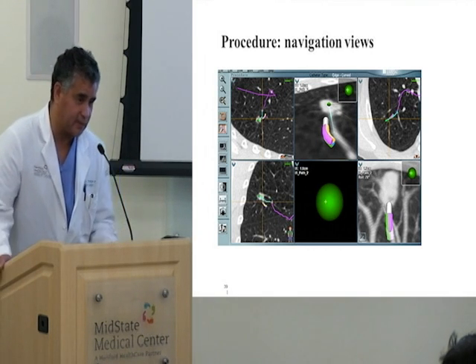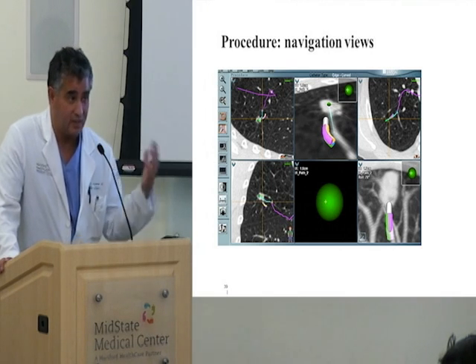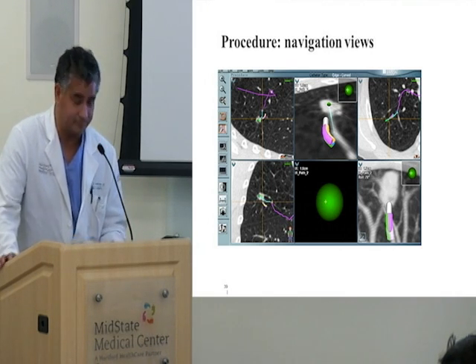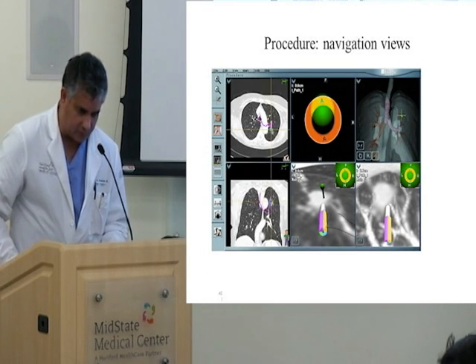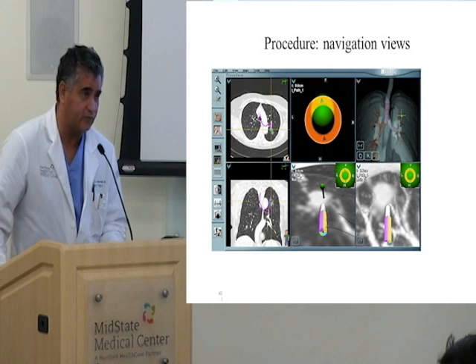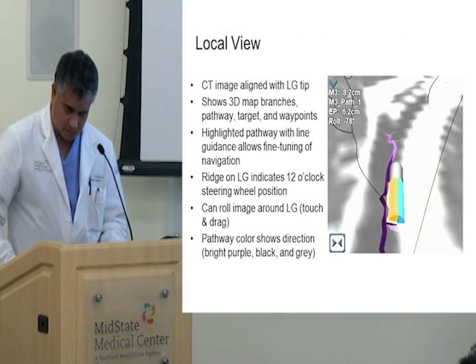So it's, like I said at the beginning, sort of like a targeting system for a missile, and you can see how this was adapted from military technology. That allows you to do a bunch of different things in terms of biopsying, and we'll get into that in a second, but let me show you.